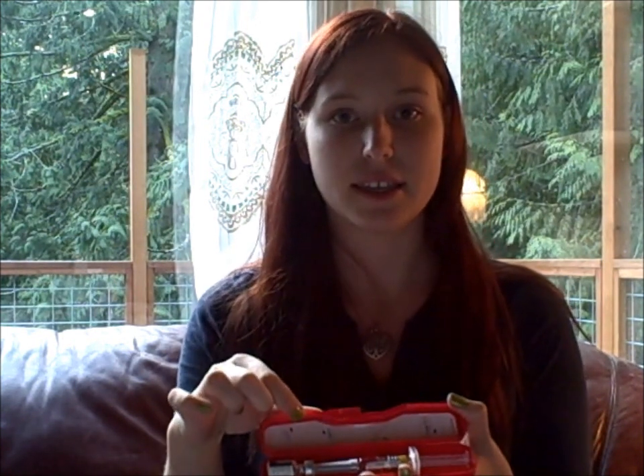Most type 1 diabetics keep their supplies close at hand. I keep mine in this orange case, which makes it easier to carry and find when needed. The glucagon kit is at the bottom. When you open the glucagon kit, you will find a folded piece of paper giving detailed instructions on what to do. There will also be a piece of paper plastered to the inside lid giving pictured instructions on what to do.